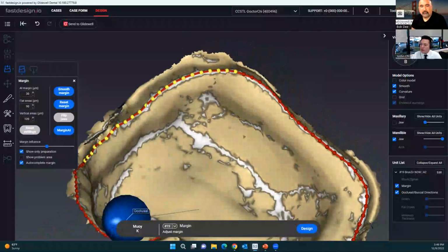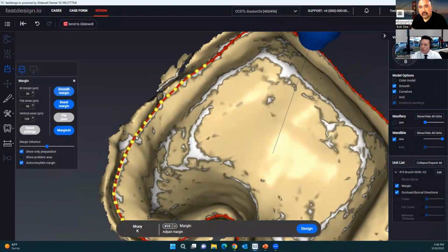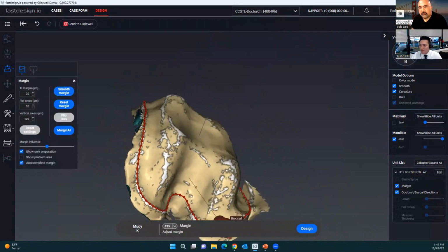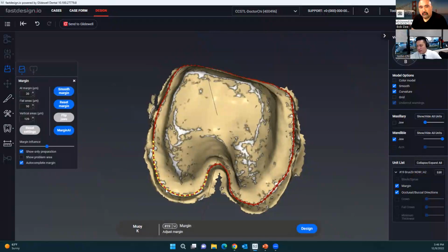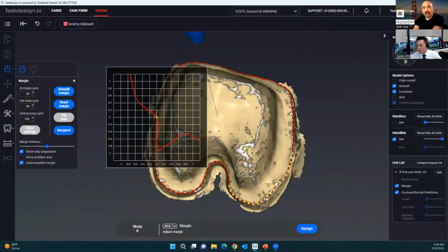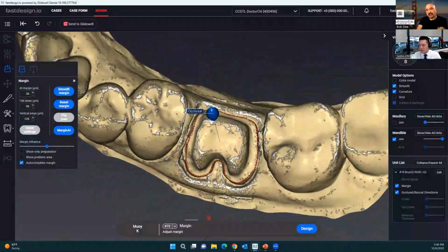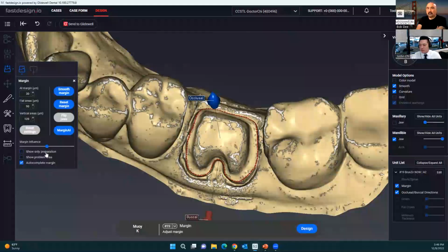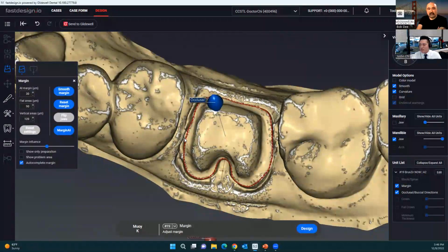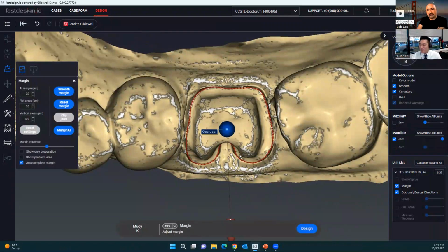While you're doing this, I wanted to stress that in this step, we actually use all the options. I use curvature, I use preparation only, but when you take the preparation only check box off, when you see the whole prep, it shows you the tissue even better. So now you can readjust. We use all of them at the same time and make sure they check out in every little step. It helps to use them all at the same time and then one at a time.